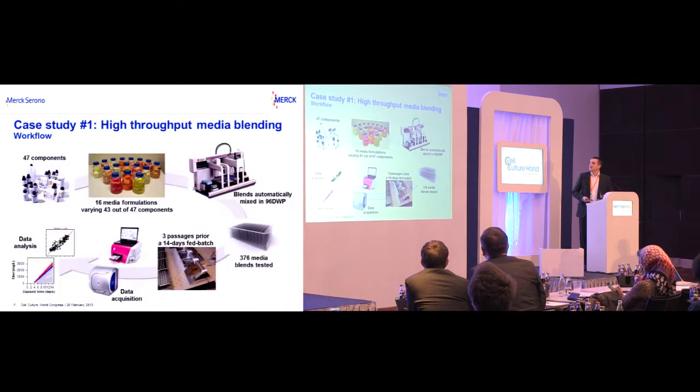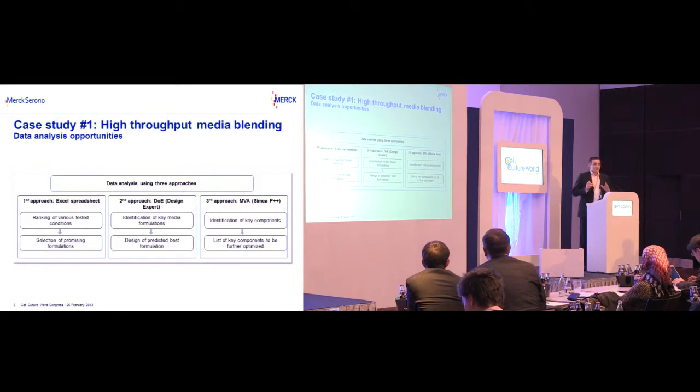In the second approach, something I didn't mention here, we blended the 16 formulations together using a mixture design. So we were blending 2 media together in a 1:1 proportion and 1:2 proportion. So it's a kind of design of experiment.